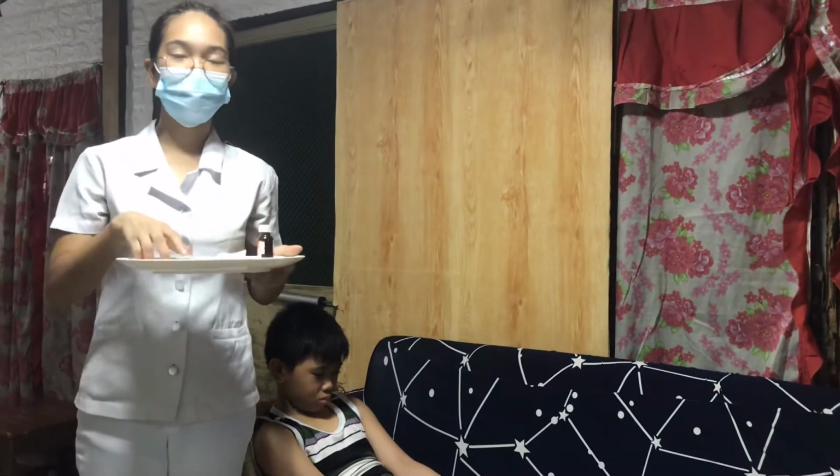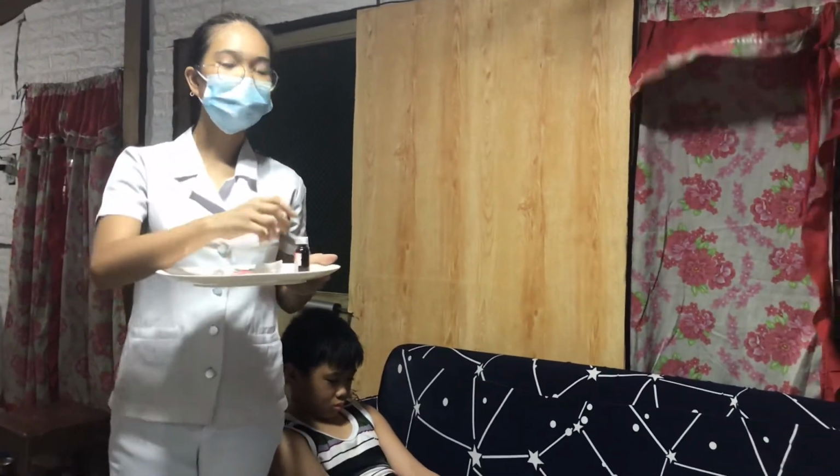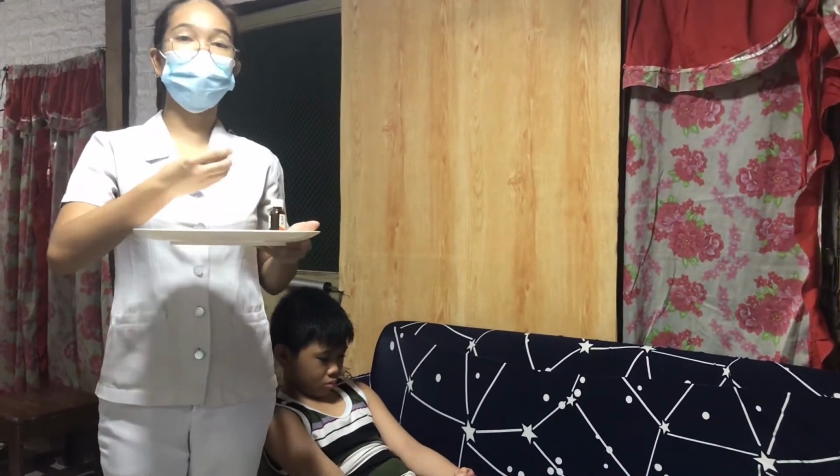So this is my hypodermic tray. I already have the syringe, the vial. Let's just pretend that this is a vial, and an antiseptic swab.